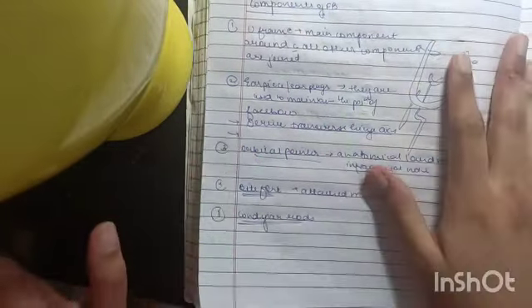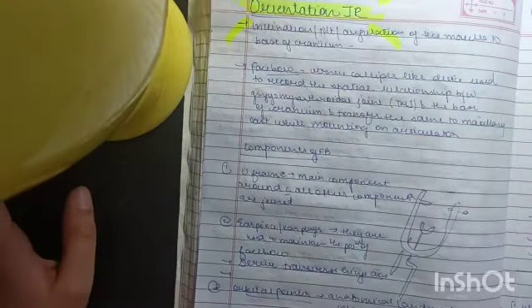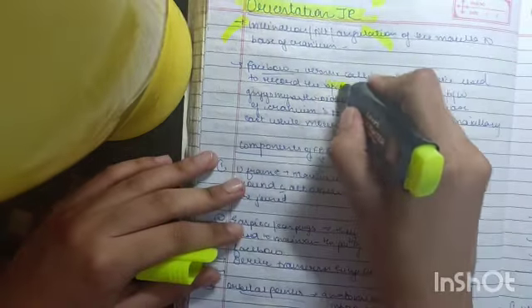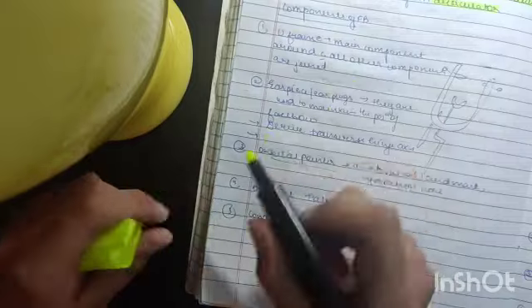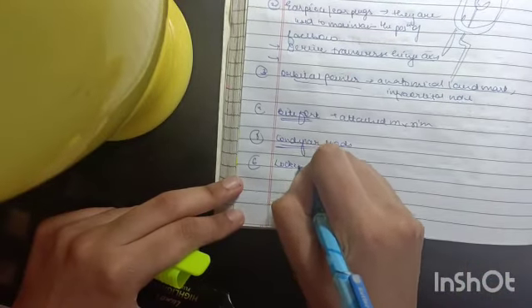and thus the recording of orientation jaw relation is done. So just to sum up, orientation jaw relation is the inclination of the maxilla, or the angulation of the maxilla to the base of cranium. Then secondly, the face bow is a caliper-like device which is used to record the spatial relationship between the TMJ and the base of cranium, and then transfer the same to the maxillary cast while mounting on the articulator. Now components: U-frame, earpiece, condylar rods, orbital pointer, bite fork, and locking screw as well.